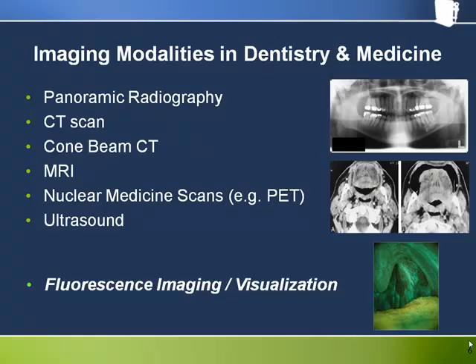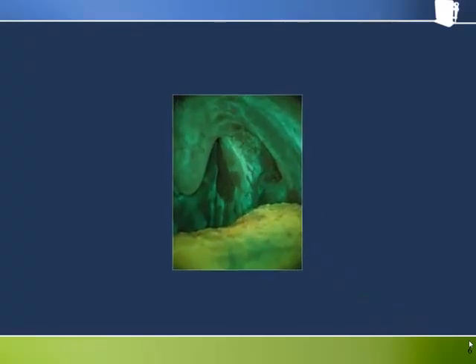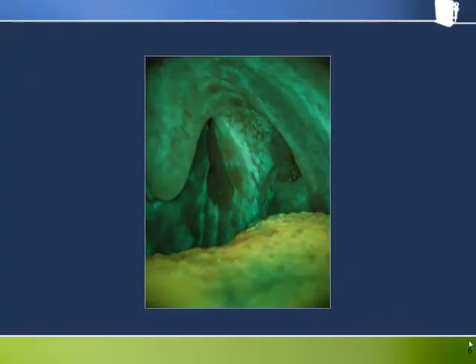Also, unlike some of these other methods, ease of use is a big plus. Tissue can be visualized in real time directly with our eyes. For a permanent record, the fluorescence information can be converted into static images, or even movies without much difficulty.